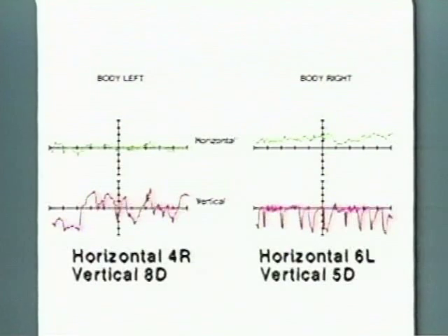Even though this is not specifically Dix-Hallpike testing, there is an example in each case of torsional nystagmus, which in fact is indicative of benign positional vertigo. This demonstrates how important it is to observe the degree and direction of nystagmus during this testing modality.